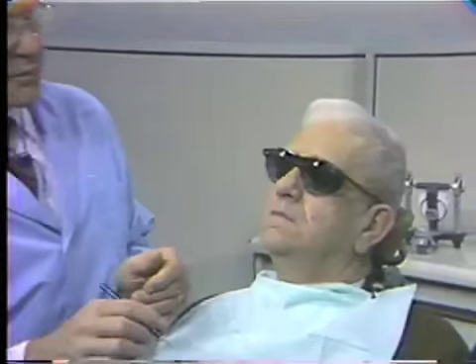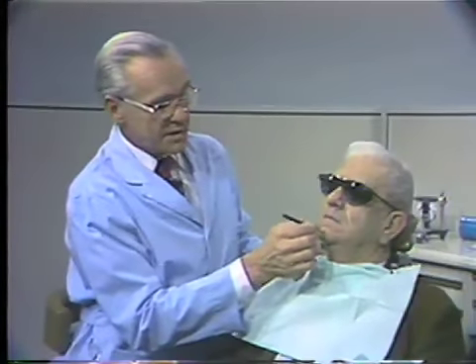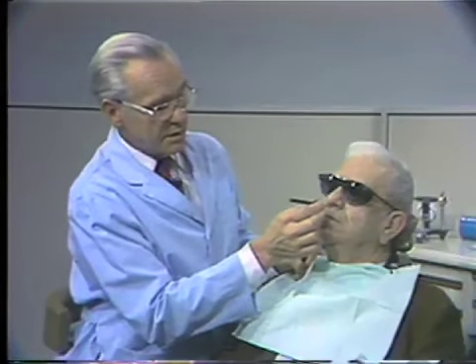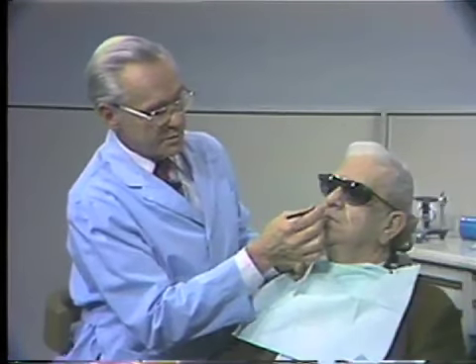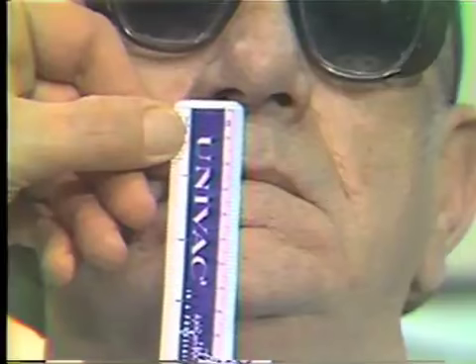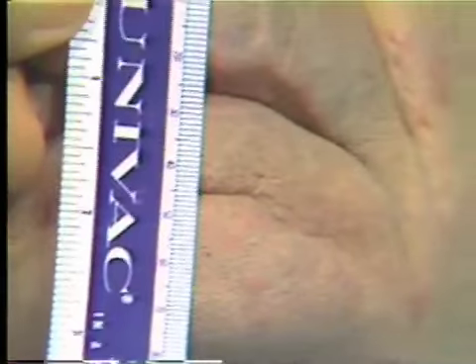We now can double check this, and we'll show you a different way of determining this, and that is one whereby we use a dot on the most forward portion of the chin and another immediately on the nose or on the cartilage of the nose and the lip junction. Now we'll measure a distance between these two dots. And when we do this, we see that we here have a distance measurement of exactly 57 millimeters.